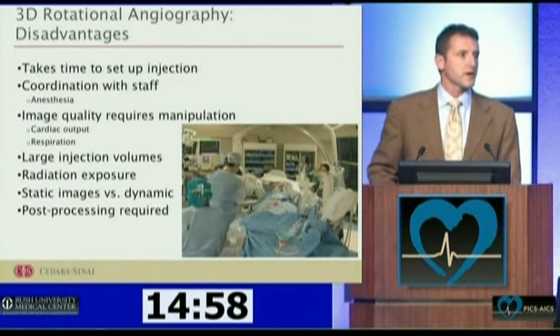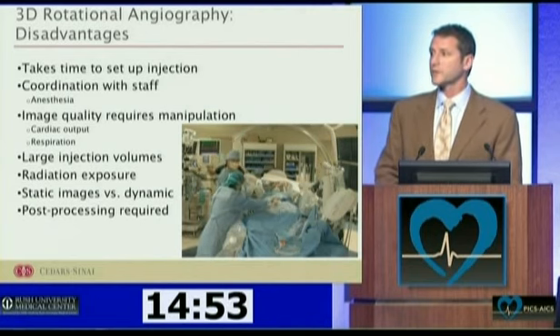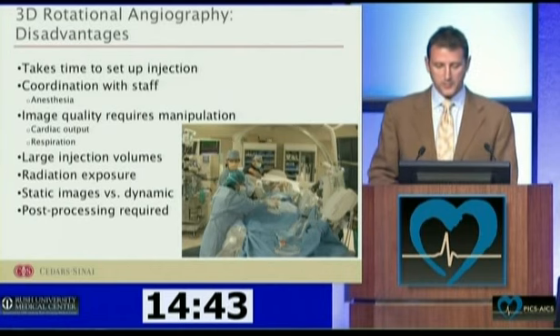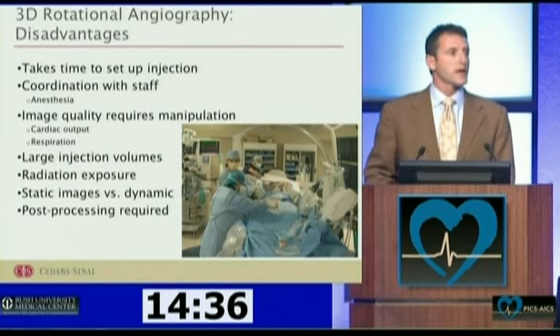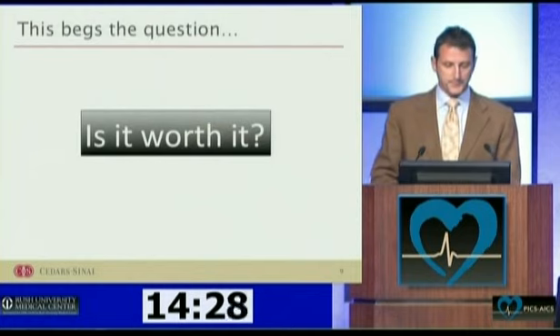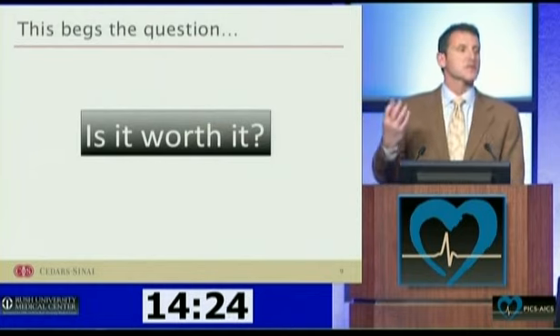Although the dye volume is really quite acceptable, the fluid volume is significant, and as we all know, kids tolerate that pretty well. Most kids, but I'm sure if we do this long enough, we'll find some patients where that turns into an issue. Radiation exposure was a big question when this came out, and I think we're getting better at answering it, but we need to acknowledge it. The images, if you heard, are static, which has clear disadvantages over dynamic images. And although post-processing, I would agree with Dr. Benson, is an under 2-minute proposition, it's 2 minutes we didn't have to spend before. So the question becomes, and the rest of this talk will deal with this question: is it worth it?